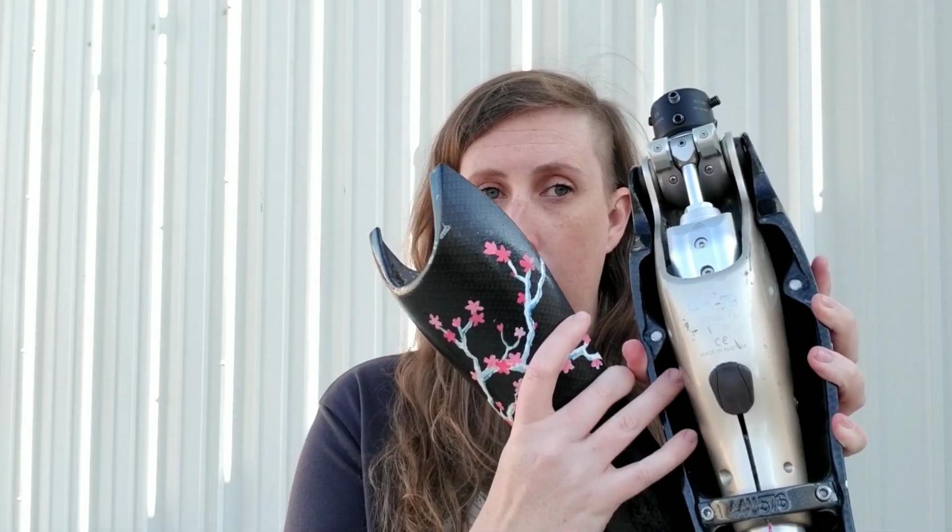I ended up doing the black carbon fiber, so you can see that it's calf shaped. This is basically the size of my calf, and then they narrow it down, but also shape it to the size of your prosthetic. This is my old knee, as I just got a brand new knee a couple weeks ago. So this is the old knee, and they basically form it to fit the size of it.